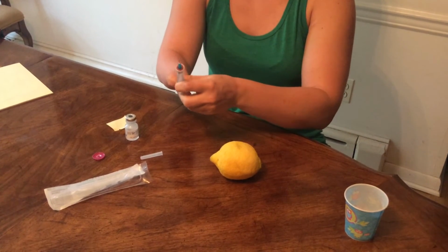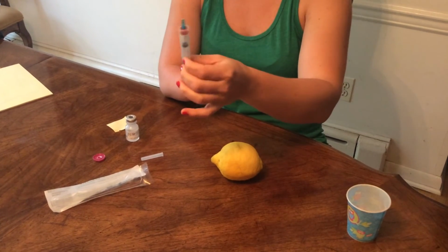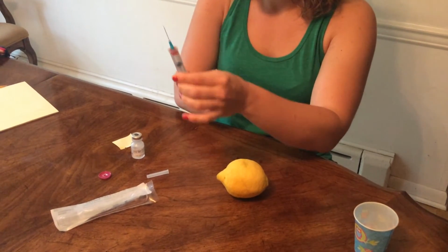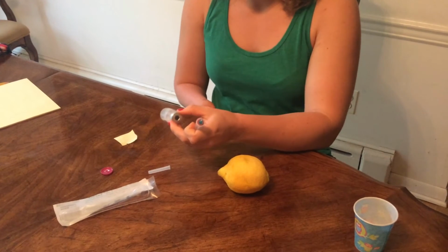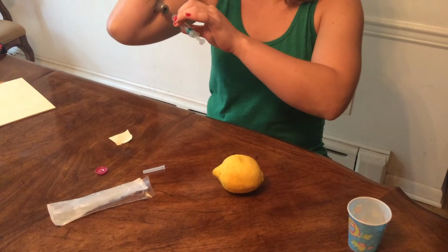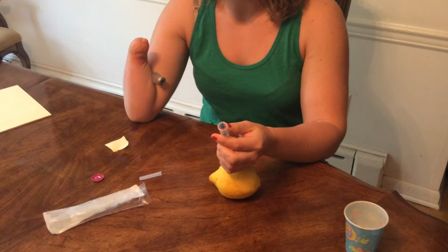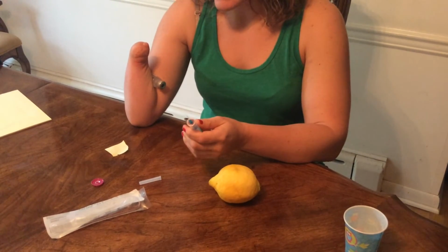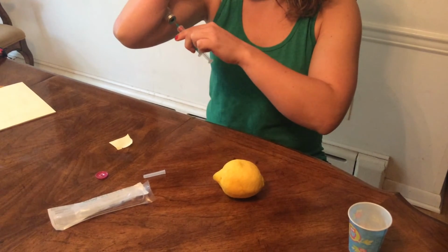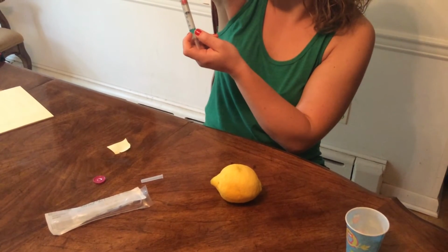Okay. The next thing you need to pull down to what you want to get. So I'm going to just do 1 cc. Okay, so the top of the black is there at 1. Okay, next step. So you're not in danger of stabbing yourself while you're doing it, because a lot of people would want to go straight on. But a lot of times during nursing school, you're going to be fidgety and shaking, you're going to be nervous. So the best way of handling that is to go at it from the side first, then go, and then you're already in. Then you want the needle below water level.